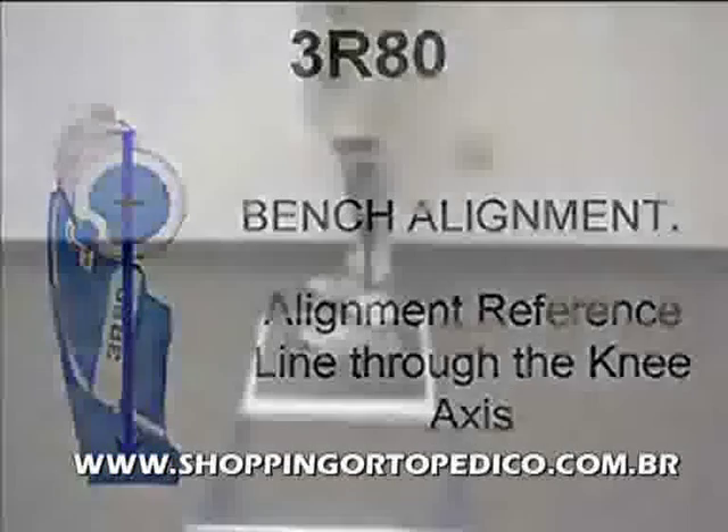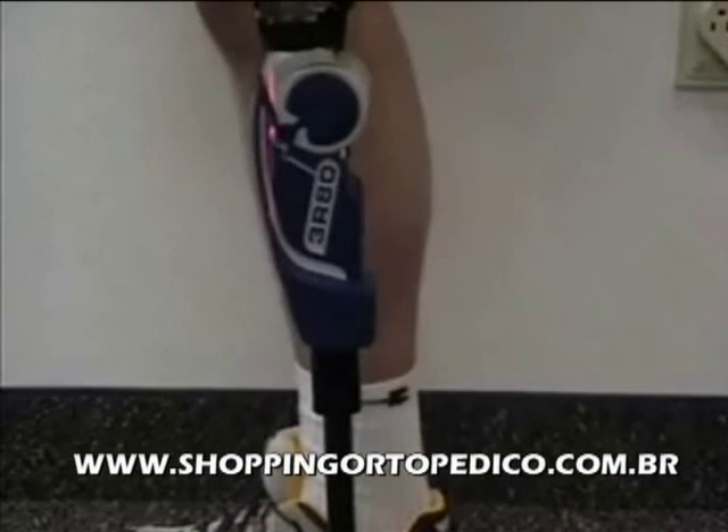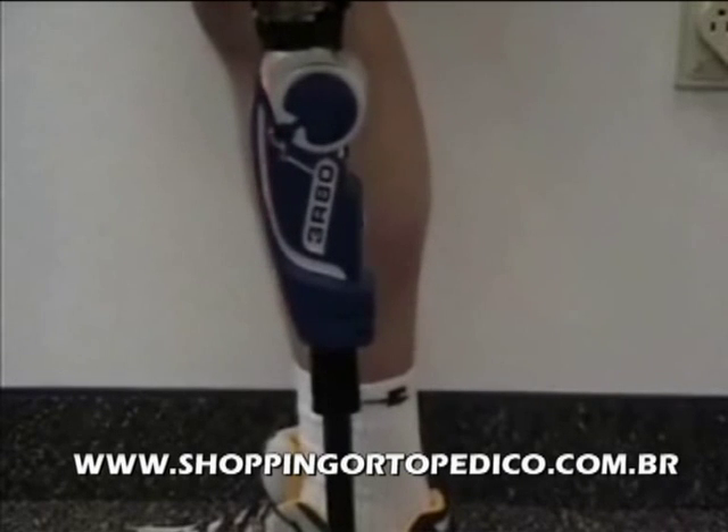The next step is to statically align the prosthesis with the patient. Static alignment can best be optimized using the laser posture. On the laser posture, the load line should fall 40 millimeters anterior to the center of knee rotation. Height and standing balance should also be optimized at this time.